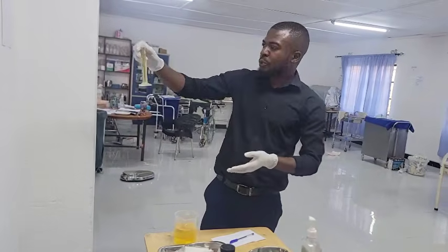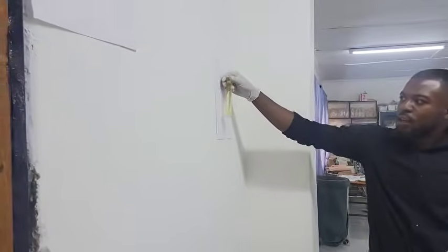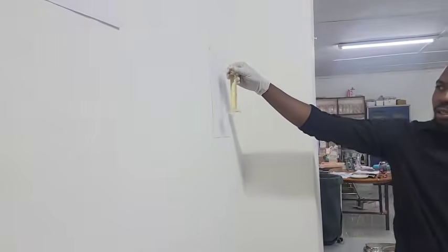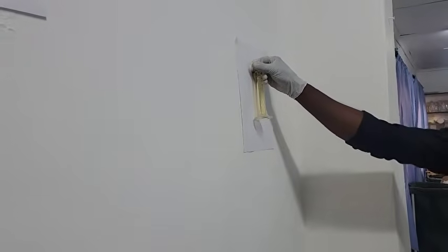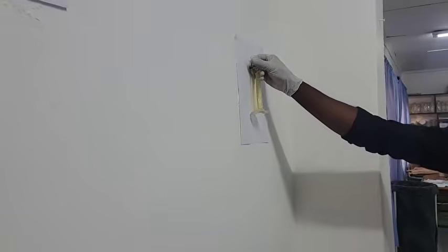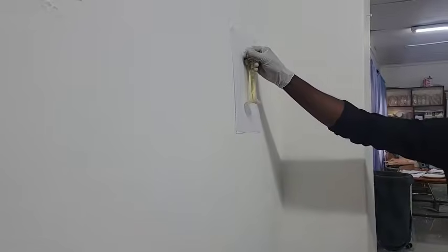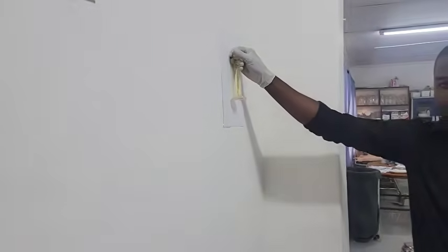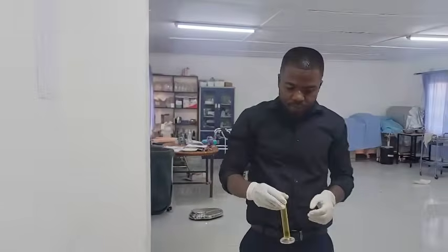The last thing you are going to do is use the piece of paper here to check for the particles. You do this on the piece of paper, and it will help you to see if there are particles inside. In this case, there are no particles. So you tell the examiner, my examiner, there are no physical particles in the urine. If you are able to see particles, you mention, my examiner, I can see there are physical particles in the urine.